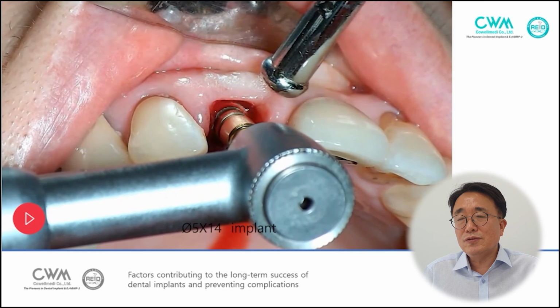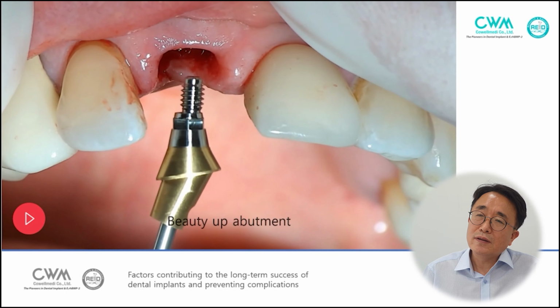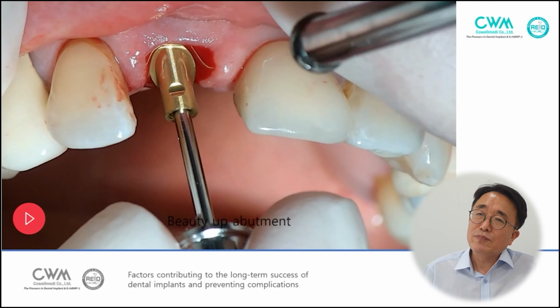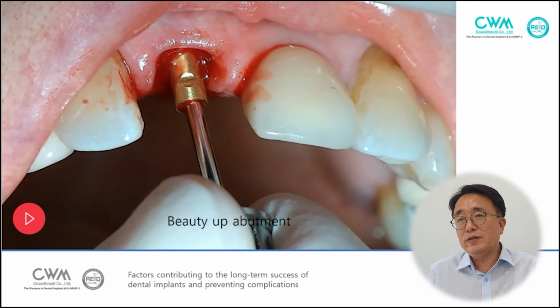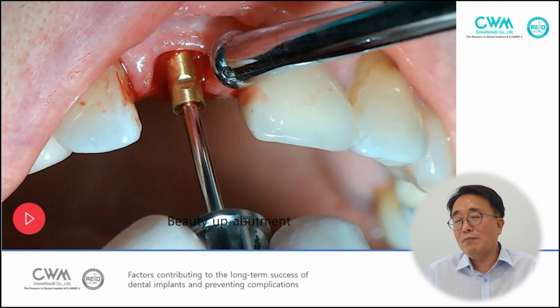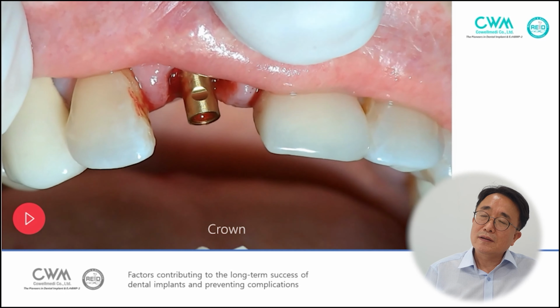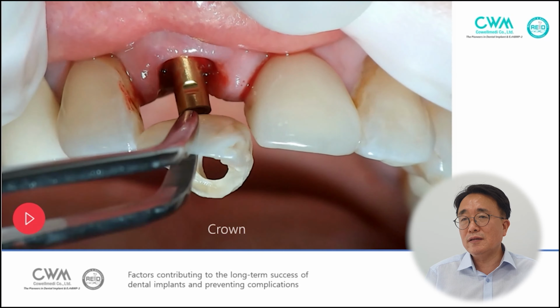So we have to keep this healing period at least 3 weeks in the acute infection site. After the 3-week healing period, we can remove the granulation tissue as one mass without infection, and we can insert the immediate restoration.